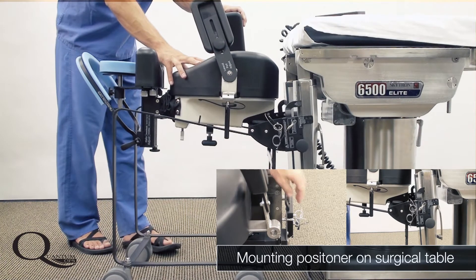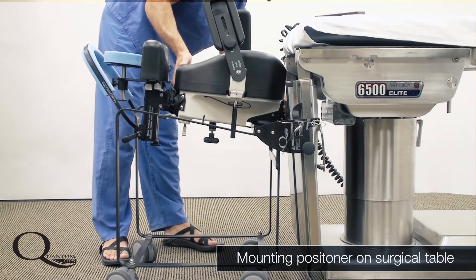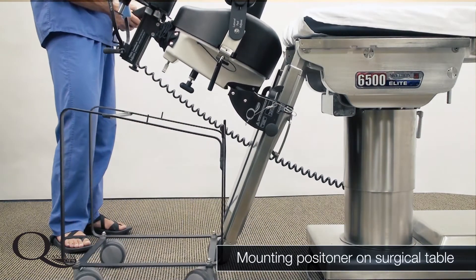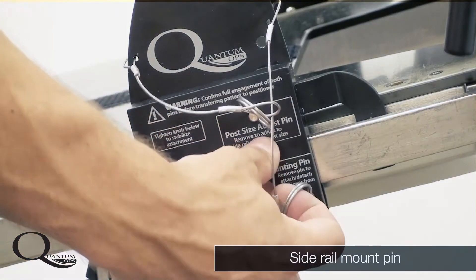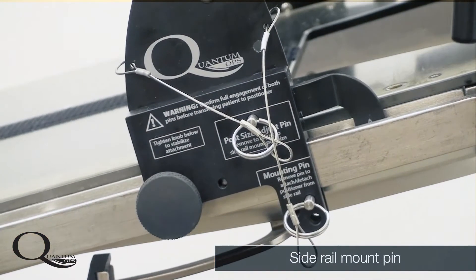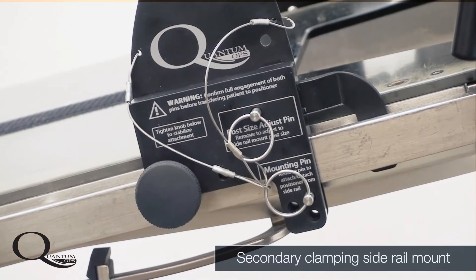The Quantum shoulder positioner is the first shoulder positioner to offer no-lift mounting to any surgical table. This allows the operating staff to have a far more pleasant experience when setting up for shoulder cases. Other shoulder positioners require them to lift often very heavy devices and place them over the leg section or back section of the operating table — a very difficult process universally dreaded by most operating room staff. A simple insertion of one quick release pin per side allows the Quantum shoulder positioner to be securely fixed onto the side rail of the leg section of the operating table.